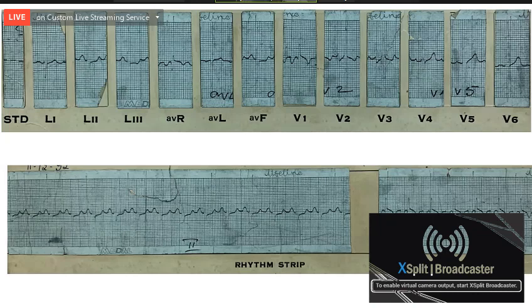Okay, what does the electrocardiogram show? Is the patient in normal sinus rhythm? Describe the P waves. What is the axis? Any abnormality in the QRS complex? I'm surprised that the final year DM students are not able to analyze this. This is a very simple ECG.